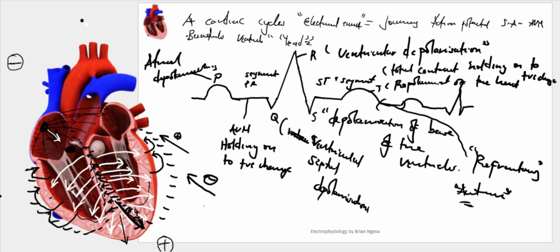So in your ECG, what are you likely to anticipate? You are likely to anticipate something of a bigger amplitude, maybe a much taller P wave, a much longer P wave, or sometimes it disappears. What does it mean when you get the double P waves? So there are many perspectives now depending on the disease context.